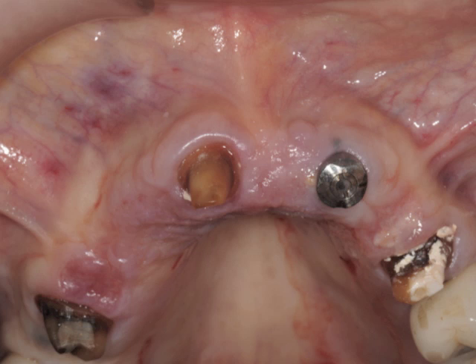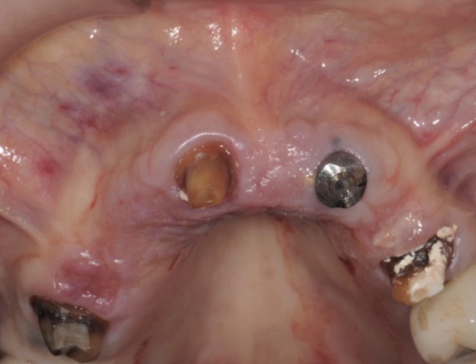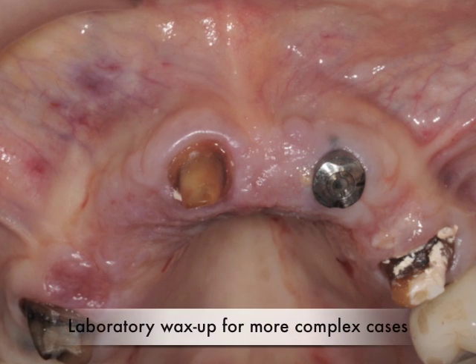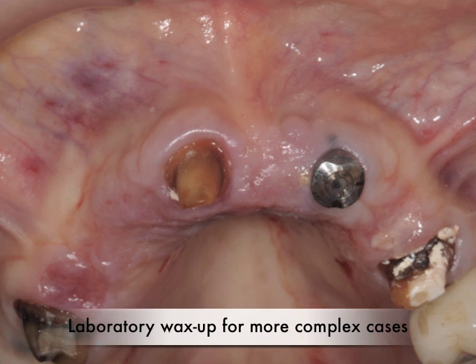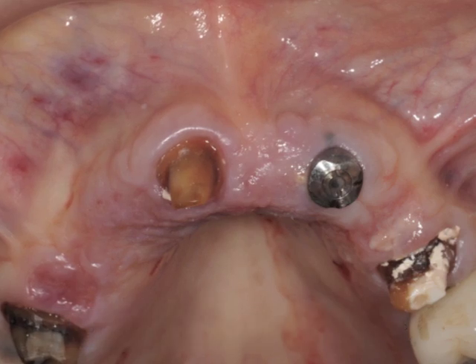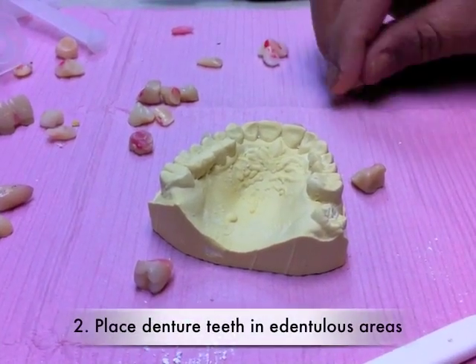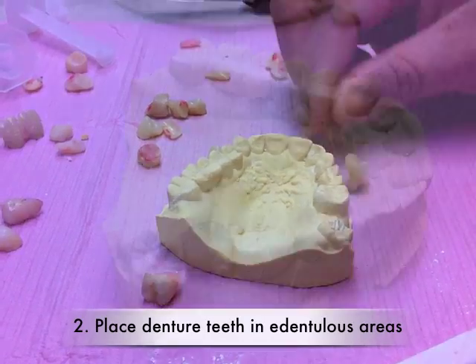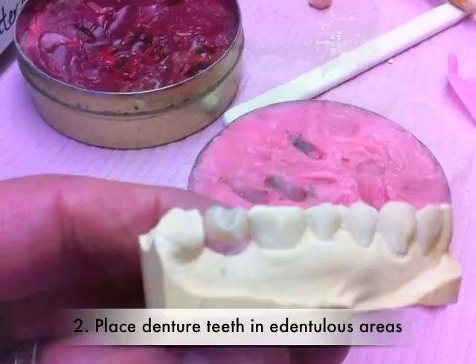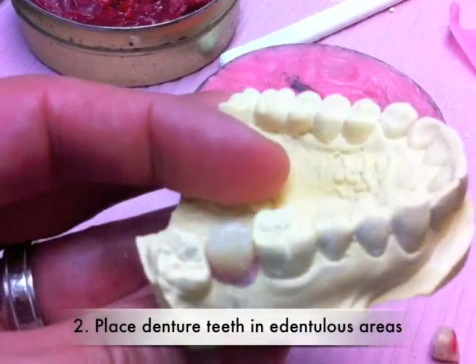With more complex occlusions, multiple adjacent missing teeth, or highly aesthetic cases, it might be better to send your models to a laboratory for a complete wax up and instruct them to fabricate an imaging guide. Next, you can place a denture tooth that fits the size of the missing tooth and hold it with some sticky wax.